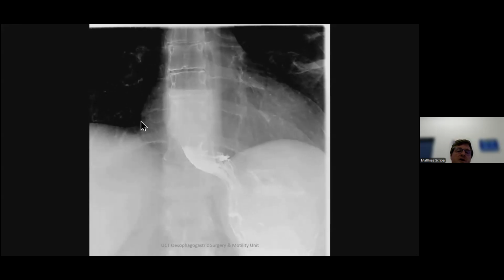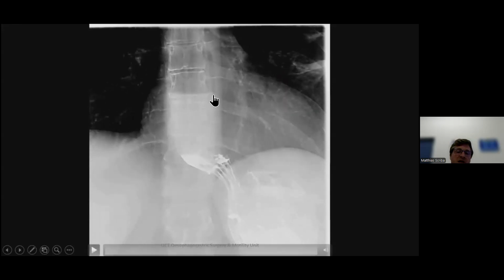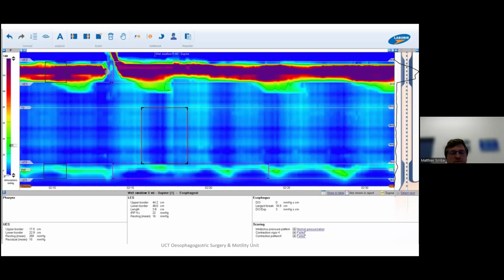Here we go. And I think what you can all see here is that there's an air fluid level or an air contrast level. And so there's hold up here. There's lack of drainage. Okay, so that is concerning. So now, are we really dealing with reflux, or are we actually dealing with a problem of drainage? And what's important with this case is that lack of proper drainage of the esophagus can mimic reflux in so many ways. And that's why manometry is so important. So fortunately, this patient came for a manometry, and this is what we found.